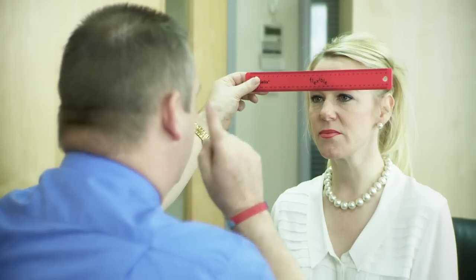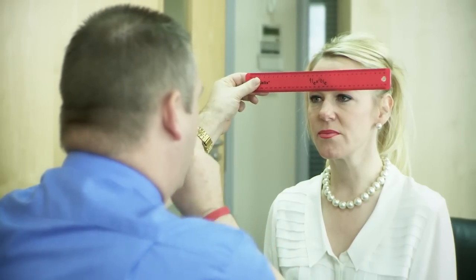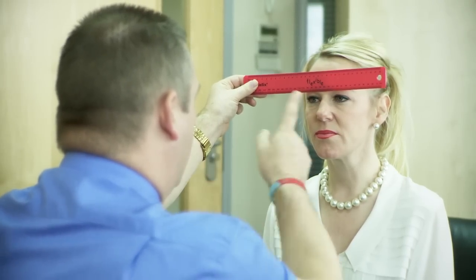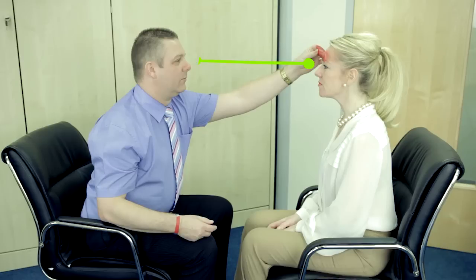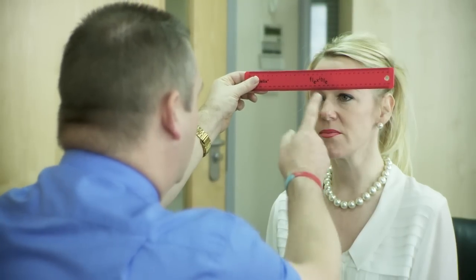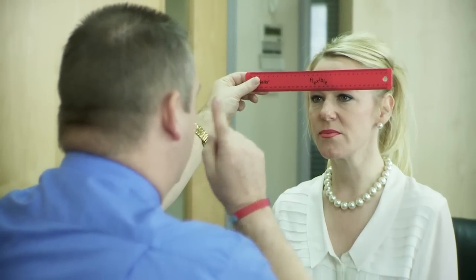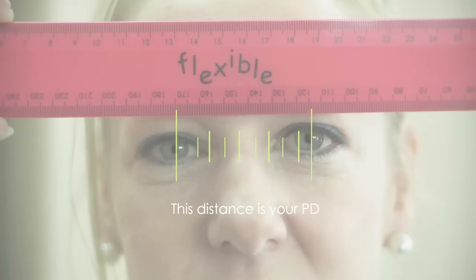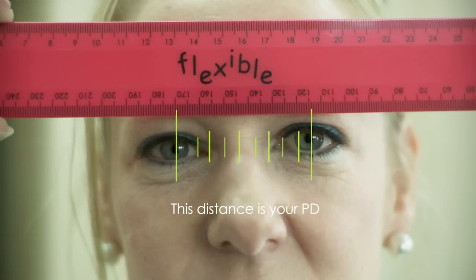Without moving the ruler, the person taking the measurement should close their left eye and use their open right eye to look into your left eye directly opposite. Make sure you are looking directly ahead into their open eye as you are being measured. Repeat the process several times until you are happy with the accuracy of the results. Remember to keep your head perfectly still as you are being measured.